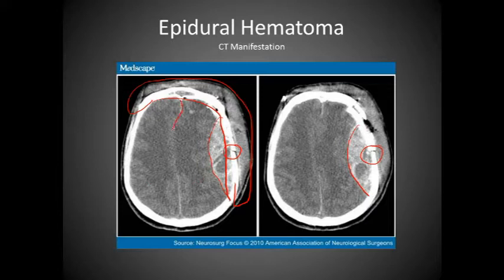Notice that there is a shift here as well, corresponding to the increased intracranial pressure. Here we see the skull fracture actually being much more problematic than this area.